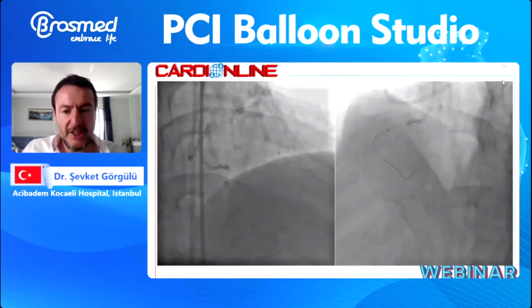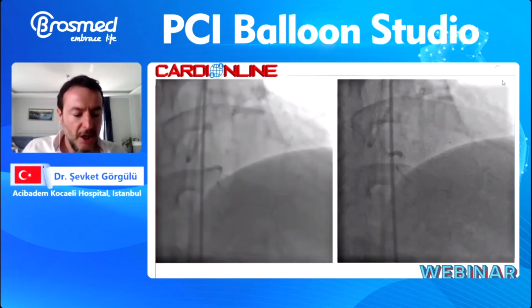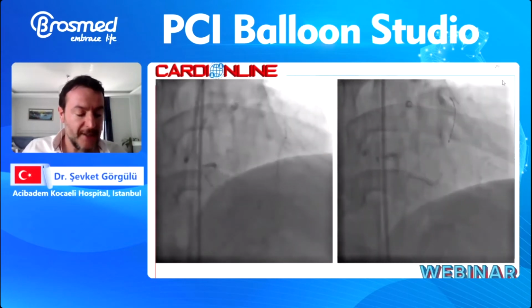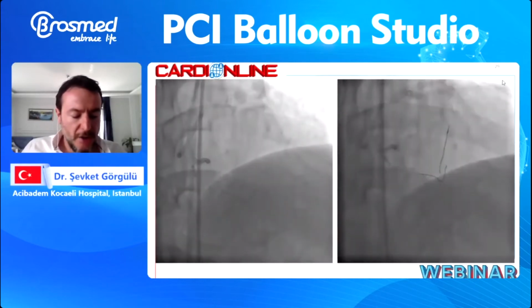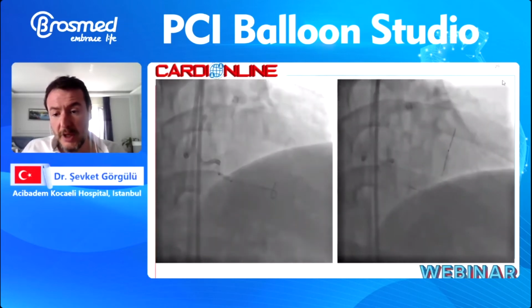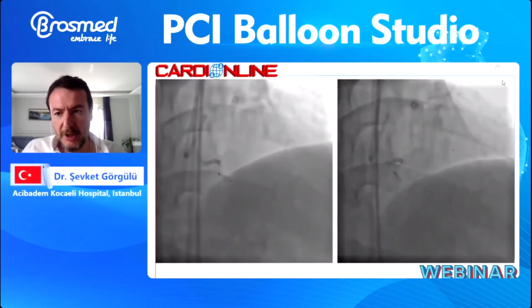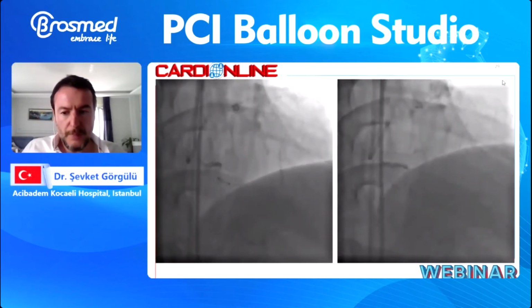Here one can see the tip injection, and of septals, to verify that we are on the right track. The Scion wire crosses the septal. Here you can see, and after some surfing maneuvers, we are through with this Scion wire here. I'm just waiting to cross the septal here, and then I will go further.